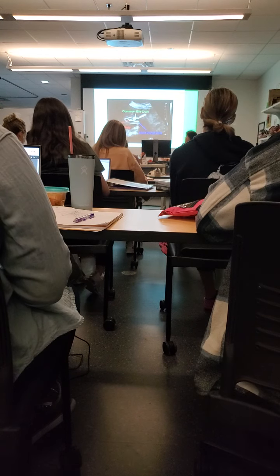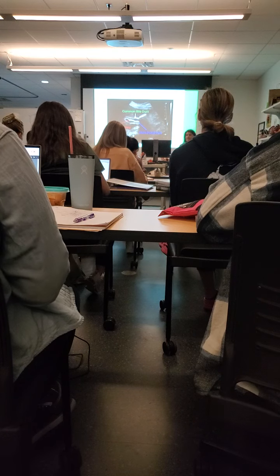Okay? You will probably see this image on the boards, and you'll have to label it. You'll see the Mickey Mouse ears on the boards. You'll have to label it. So this is something you're really going to need to know, because you're going to be doing this every single day. Anytime we scan an abdomen, all of your abdomens are going to have this, and this is where you're going to measure.